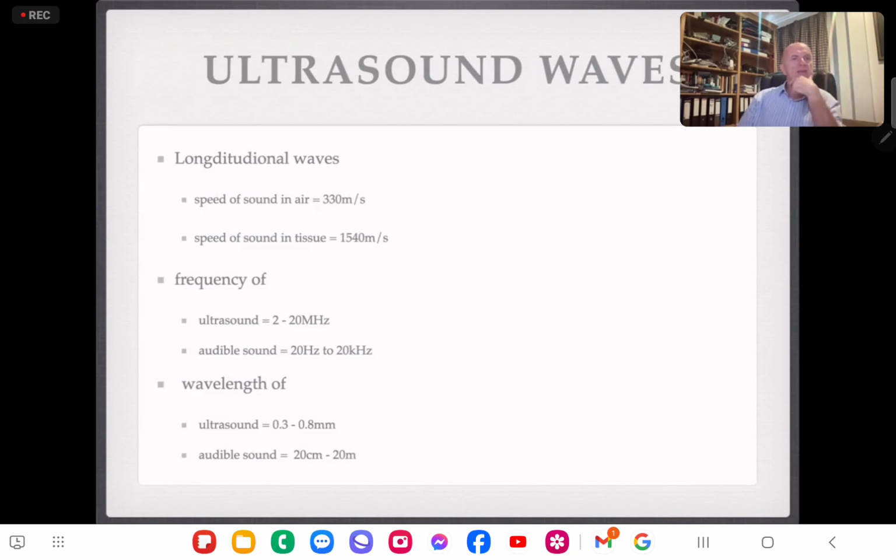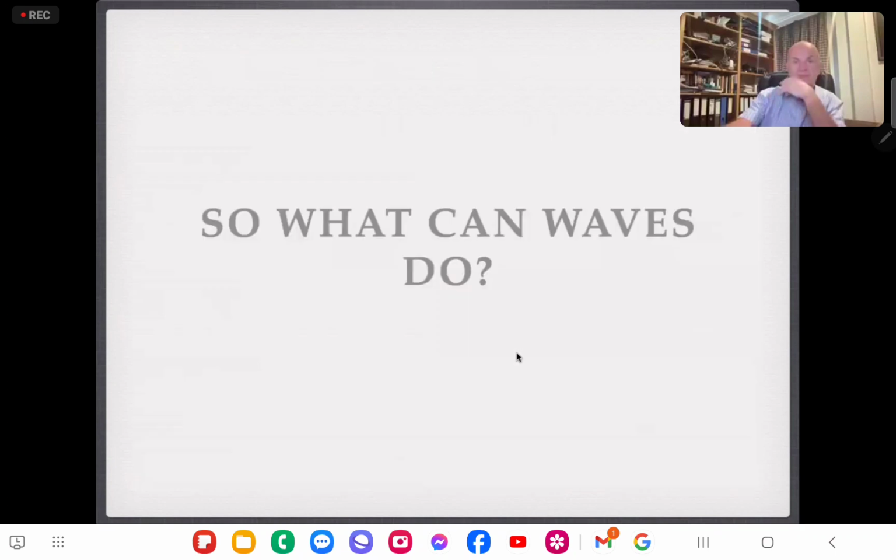Spoken sound happens at a few hundred or a few thousand waves per second, so much lower frequency. You remember the frequency just because you're used to using it, because you're used to saying it when you pick up the probe. It's familiar to you. You need to remember those numbers for the speed. If you know the speed and you know the frequency, then speed is frequency times wavelength, as we said already. Therefore, you can calculate the wavelength. So you don't need to remember the wavelength, just the speed and the frequency. So that's how you describe waves.